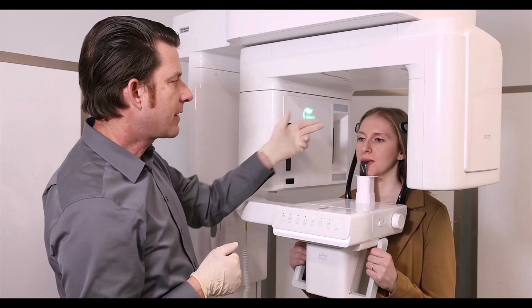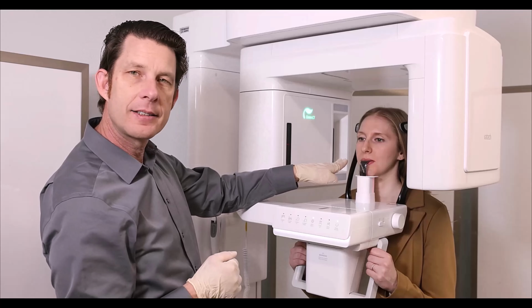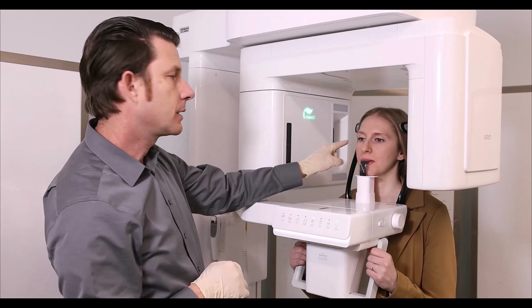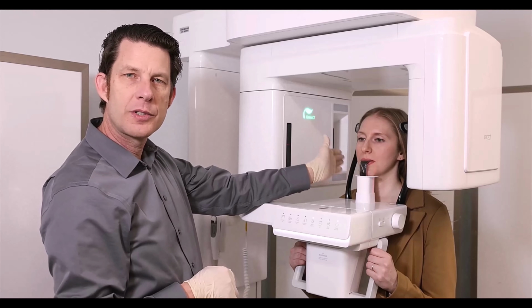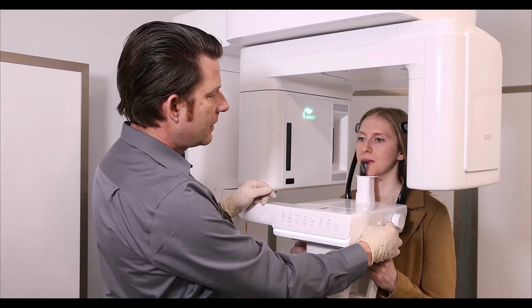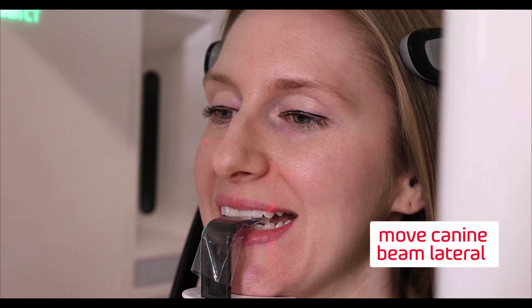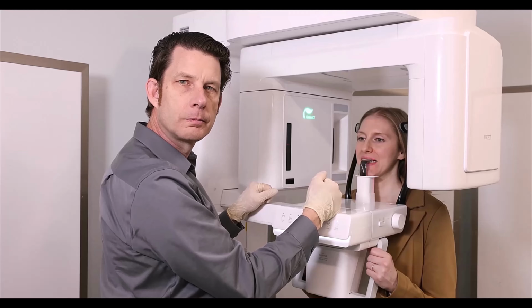So you can see here I've got the patient lined up center with the mid-sagittal beam, the occlusion slightly tipped down. We have our Frankfurt horizontal beam, top of the tragus to the infraorbital notch of the eye. Our temple supports have been closed and snug on the patient's head. Lastly, we're going to look at our canine light. Smile really big for me. And we're going to move that to the lateral, just basically moving that further forward to our lateral.